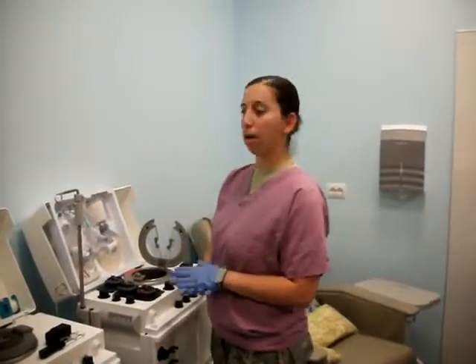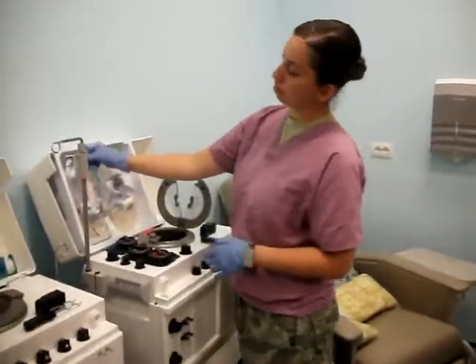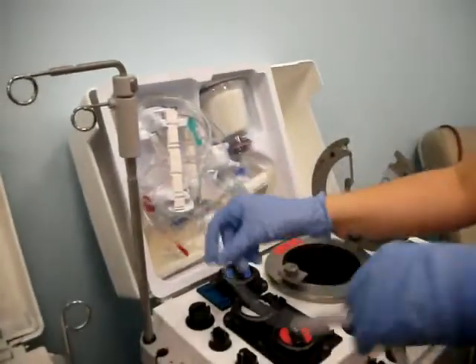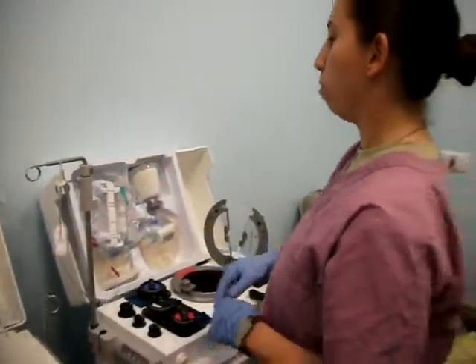Today I'm going to be showing you how to set up the Humanetics kit on the analyzer. First thing you want to do is pull out this purple line right here. You just want to untangle it and put it aside — you can either hang it up here or just let it dangle. It's really a matter of personal preference.